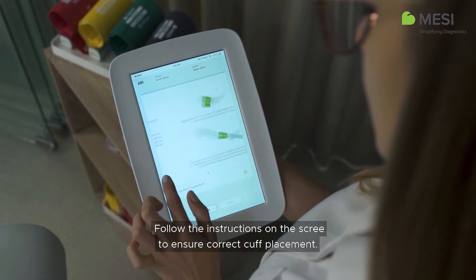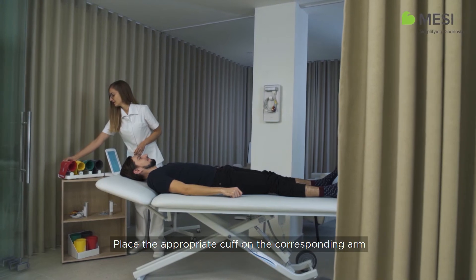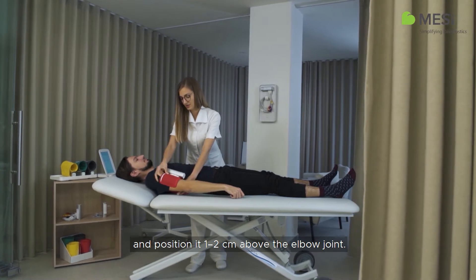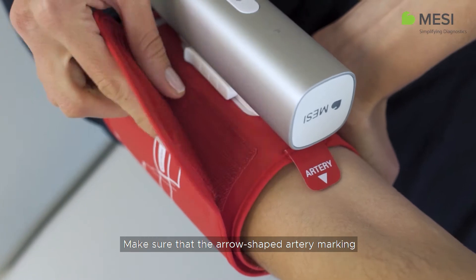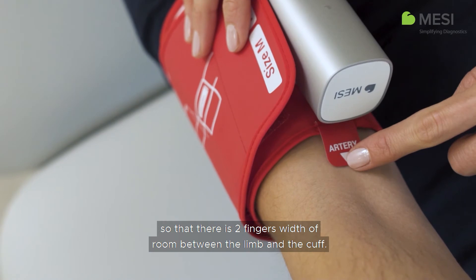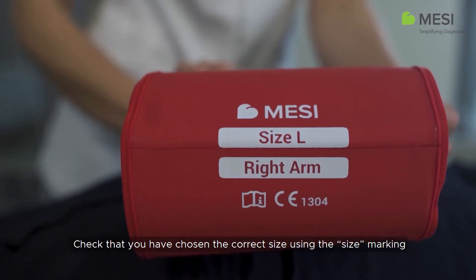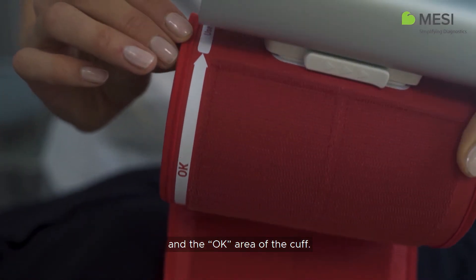Follow the instructions on the screen to ensure correct cuff placement. Place the appropriate cuff on the corresponding arm and position it one to two centimeters above the elbow joint. Make sure that the arrow-shaped artery marking is in line with the brachial artery. Place the cuff so that there is two fingers width of room between the limb and the cuff. Check that you have chosen the correct size using the size marking and the OK area of the cuff.